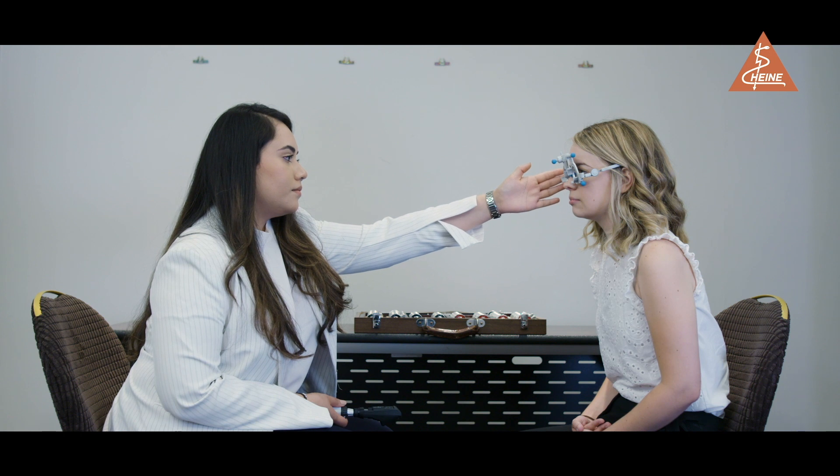The average working distance is 66 cm, which is equivalent to 1.5 diopters. The practitioner's arm can be used to work out this fixation distance in most cases.